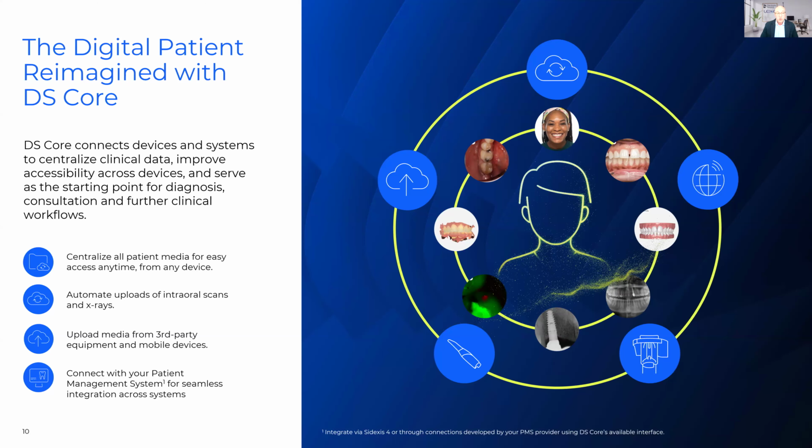And upload media from third-party equipment and mobile devices. So we have a HIPAA compliant way of bringing everything together and being able to not only share with your patients, but also connect it with your specialists as well. So you can collaborate efficiently.